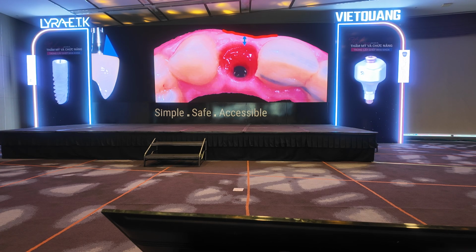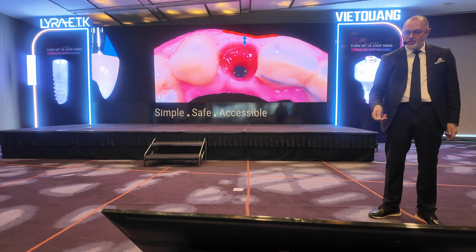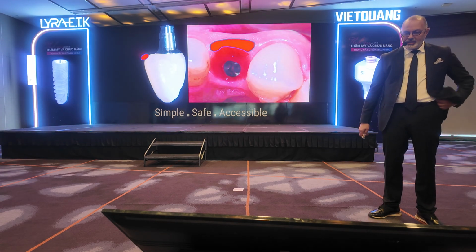And even if you need a better contour, you just need to do a very small gingival graft, without the Tarno style where you just open and put a graft down in order to have a better contour. You're not in the way like you did, where you really take your blade and open. And you know it's very important to solve the problem during the implant placement when it comes to a thin biotype like this one.